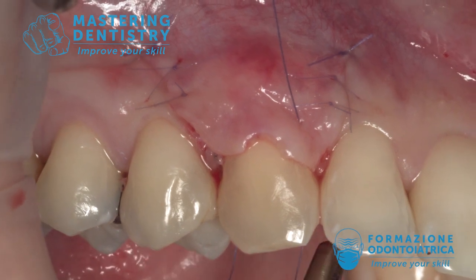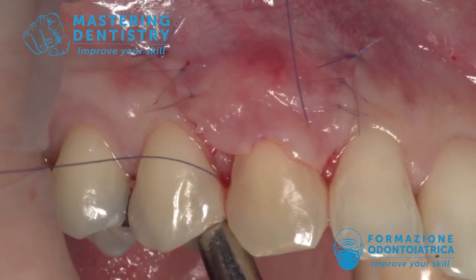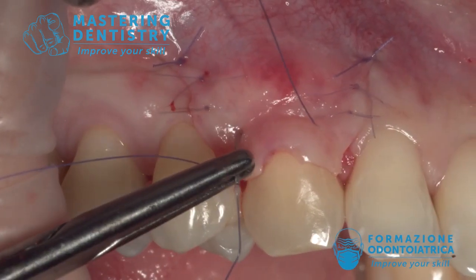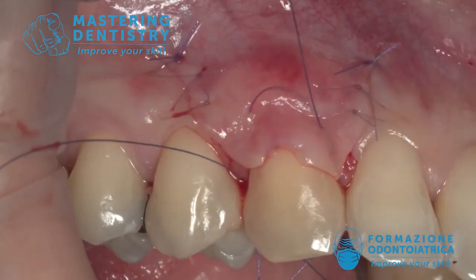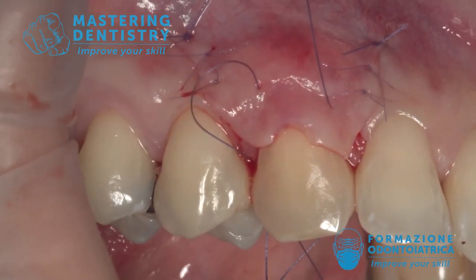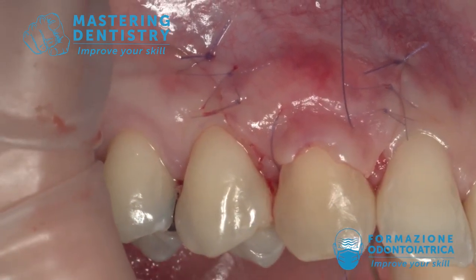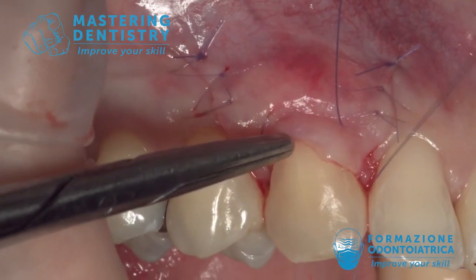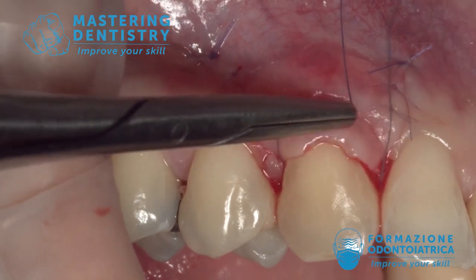To perform the sling suture, you start at the base of the surgical papilla — in this case the mesial one. You engage the anatomical papilla, go around the tooth, and come back buccally underneath the contact point with the bottom of the needle. Then you engage the surgical papilla at the basis of the distal one, engage the anatomical papilla, go around the tooth again, come back buccally underneath the mesial contact point, and tie the knot — being careful to have the wire passing in the middle of the surgical papilla.